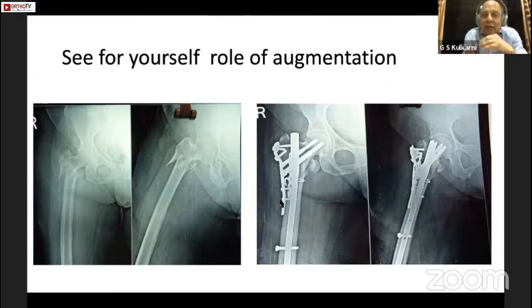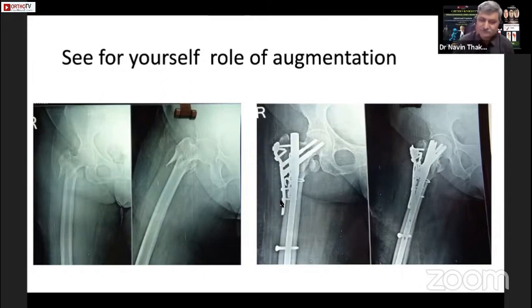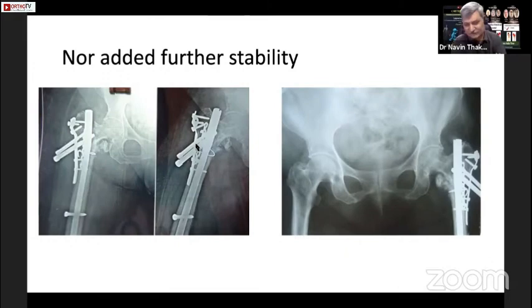Sir, but varus is not the only cause, Naveen. It is the osteoporosis also. So probably the screw is very small. It is tissue destruction without stability. Yes. There are two things. That has led to the infection. Chandak, the neck screws are not passed through the plate. So the plate is held by only three small screws from the top, which is in osteoporotic bone. This cortical bone is not having any purchase. Right. Absolutely agreed, sir. But the plate is either posterior or anterior to the screws.